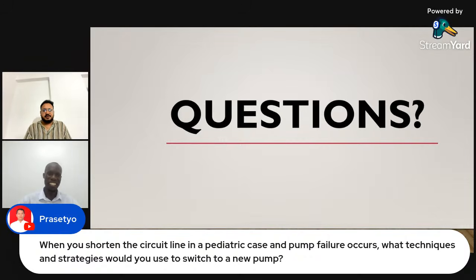Yeah, we should be prepared for all the complications. We should keep a standby pump ready and an oxygenator ready. Everything should be prepared because we never know, anything can go wrong. And I wish this won't happen with anyone. It has never happened to me, and I always pray it doesn't.